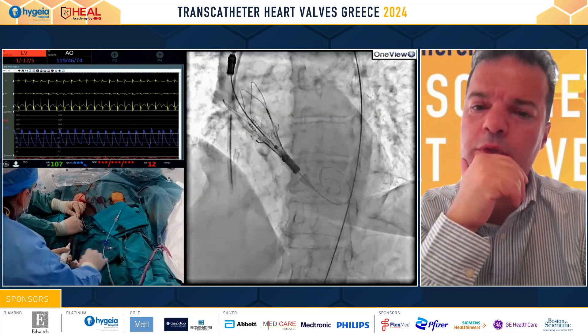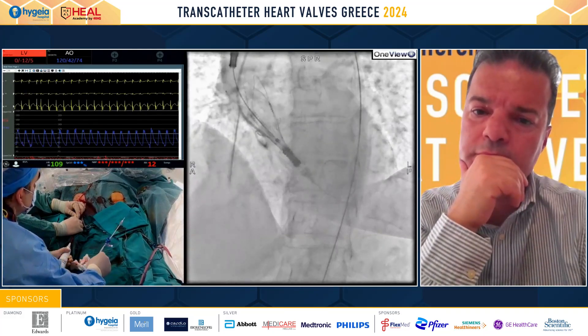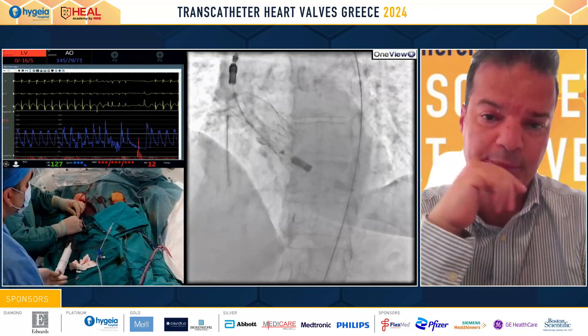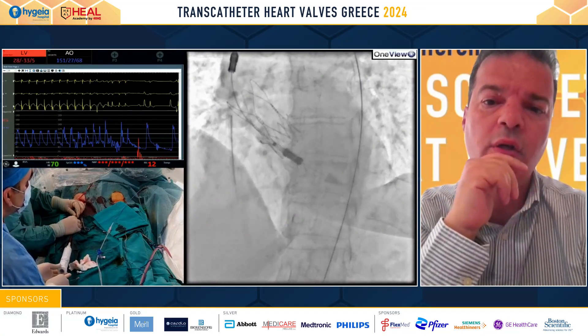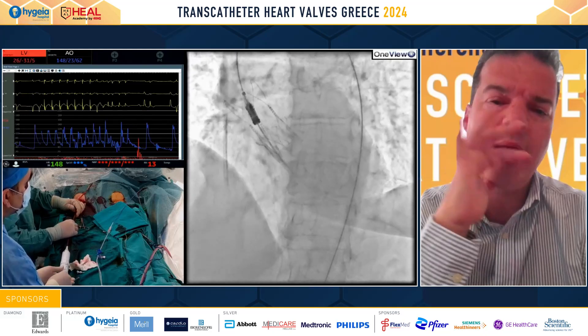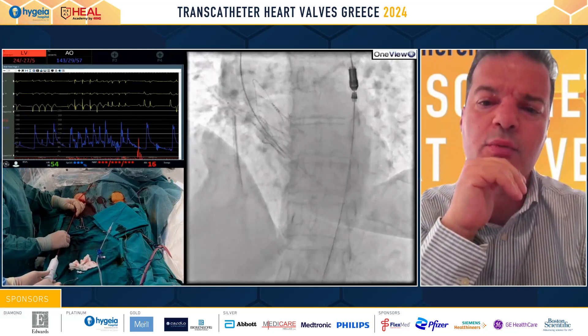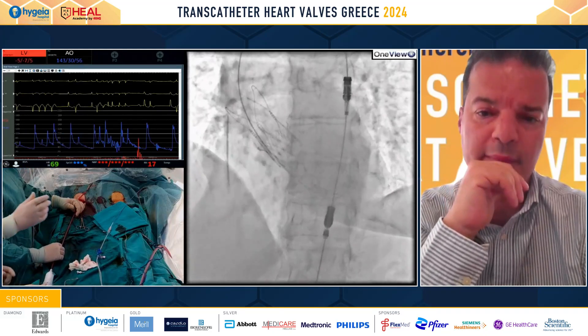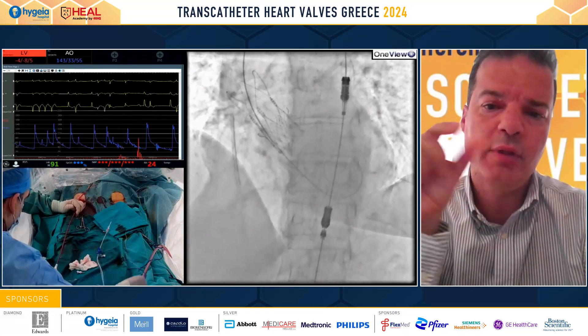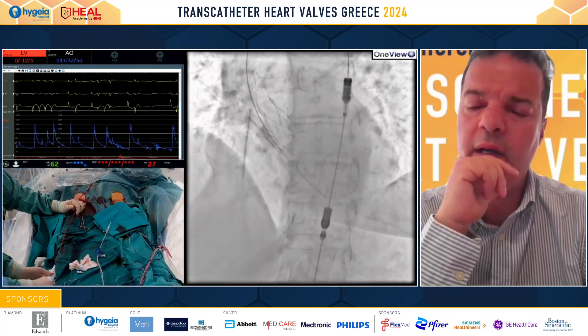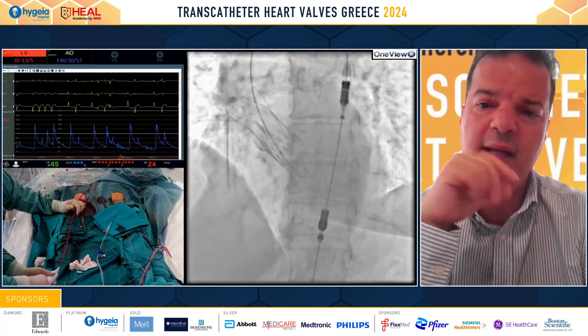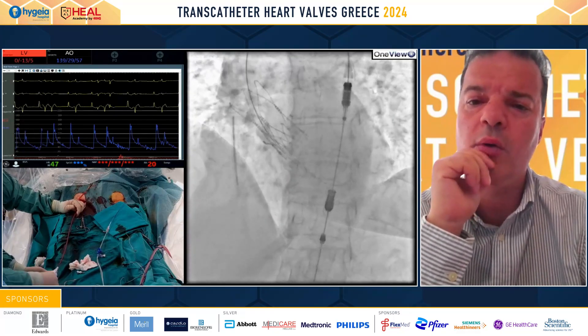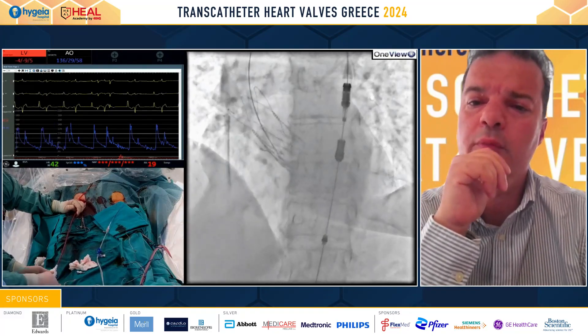Regarding the flush port position for commissural alignment — we usually insert it at six o'clock. By having it at six o'clock, it gives you an 80–85% probability that you will end up in commissural alignment. You can see the opening of the stent frame, which is very fast, then we just resheathe the whole assembly and take it out.